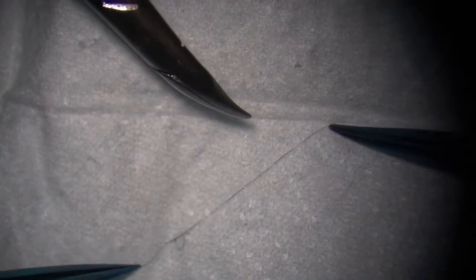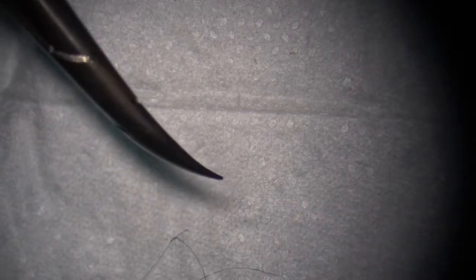Okay. Now, bring it back in front of you. Catch the suture this way. Okay. Make loops. Now you will see the suture is in front and above of your needle holder. Yeah, so once the suture is behind, under your needle holder, it's hard to make loops. So bring this back again. Back a little bit more. So now you can see. Okay, keep going. Now you see it's a little bit weird.